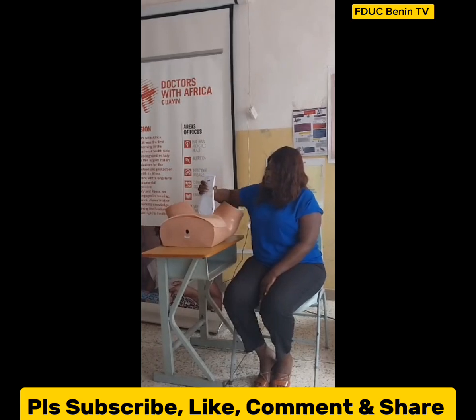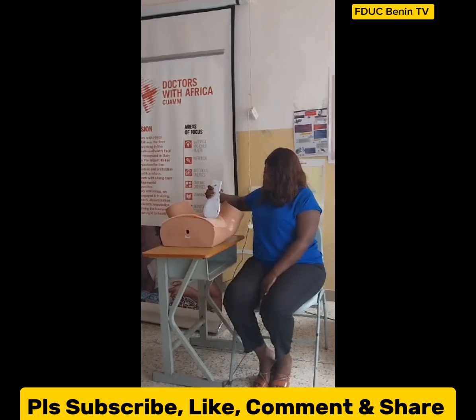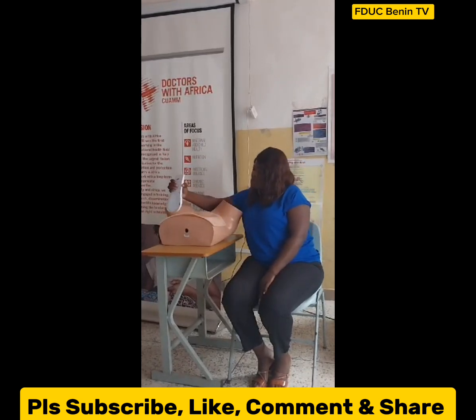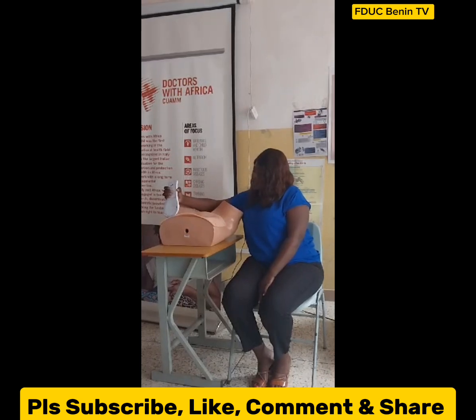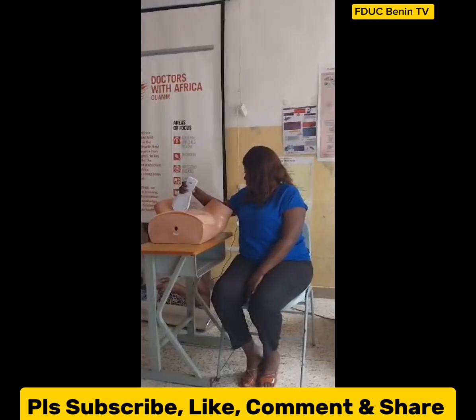Then I'll position it on the maternal right, and then slide on the narrow axis towards the maternal pelvis. While doing that, I'll also look out for any adnexal mass or cyst. Then I'll position it on the maternal left and then slide on the broad axis towards the maternal pelvis, also looking at any adnexal mass or cyst.